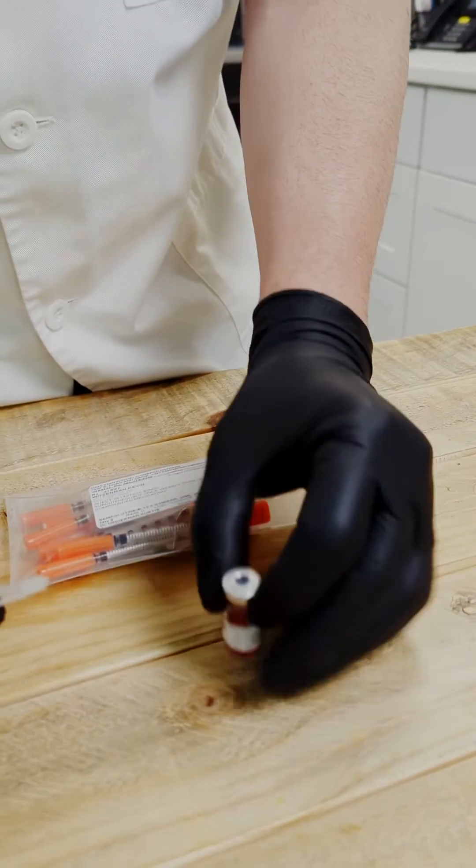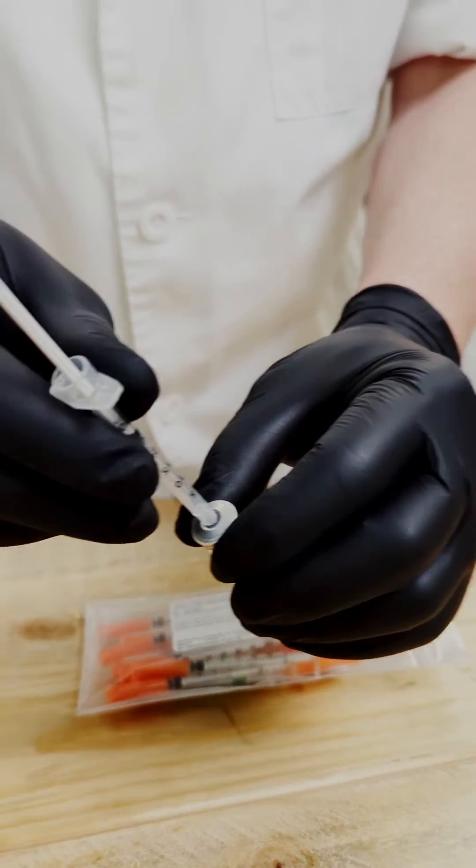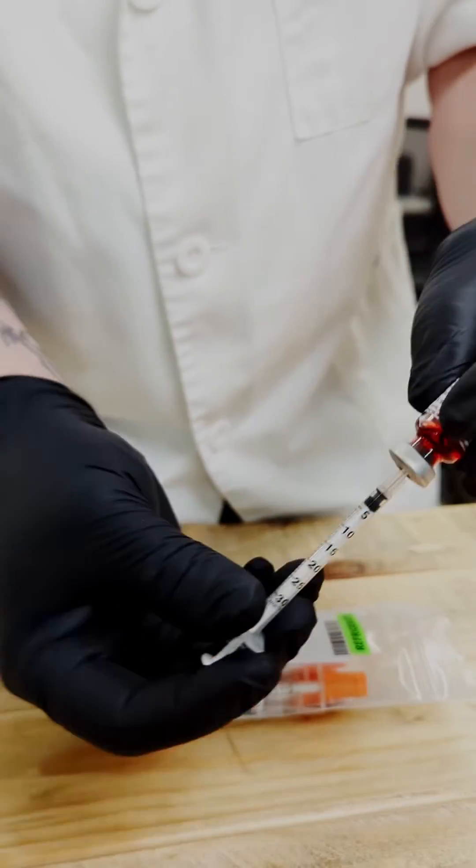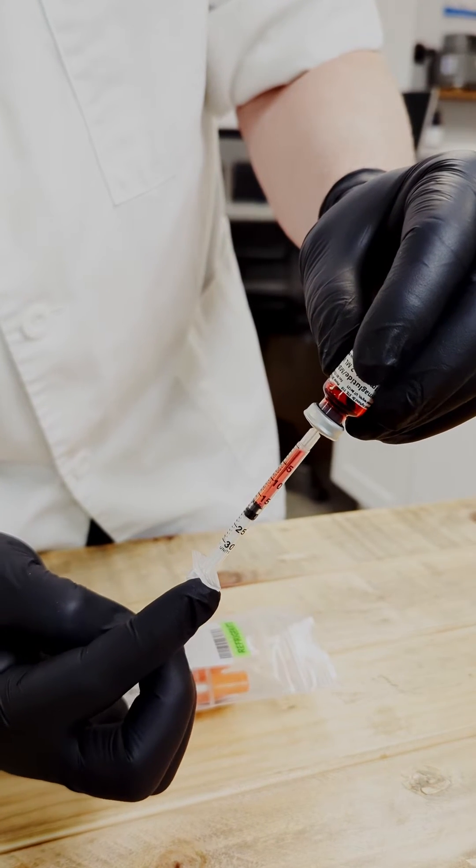We'll uncap it, poke it through, and then inject it into the vial. At this point we'll want to flip that vial upside down and draw 25 units out.